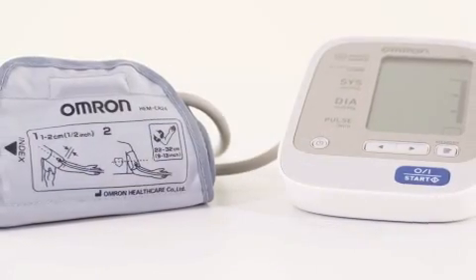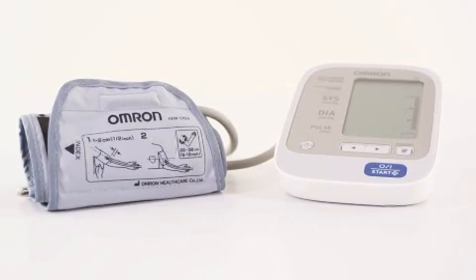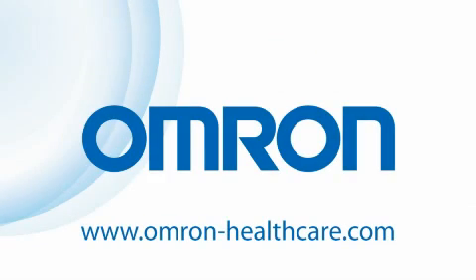The Omron M6 — for the easy and fast measurement of your blood pressure and pulse rate.